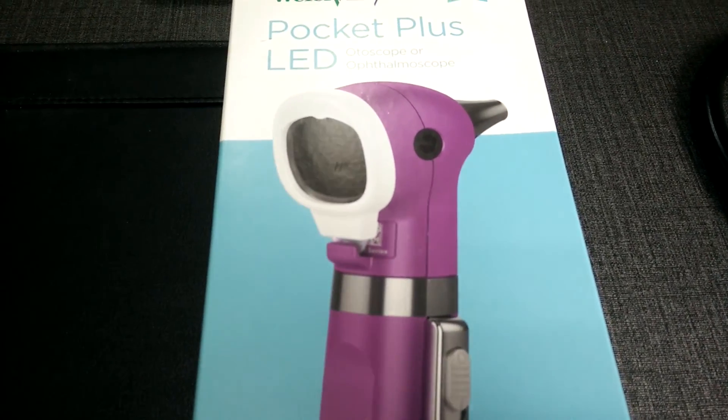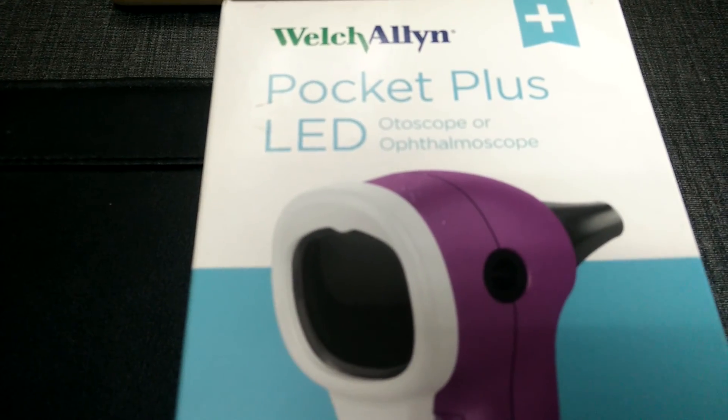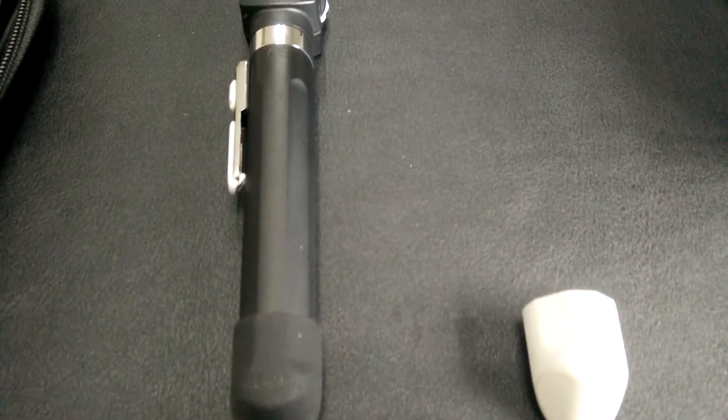Hello everyone, this is Dr. Rizwan coming to you from Bangladesh. Today we will be reviewing a device which is called the Welch Allyn Pocket Plus LED Ophthalmoscope. I have ordered this ophthalmoscope through the Medisave UK website. And you have just seen the retail packaging of this ophthalmoscope.